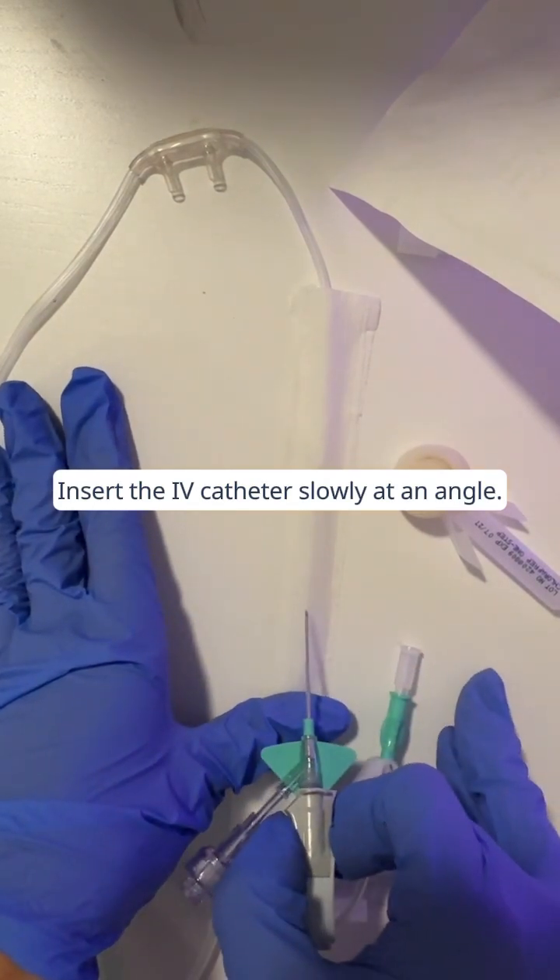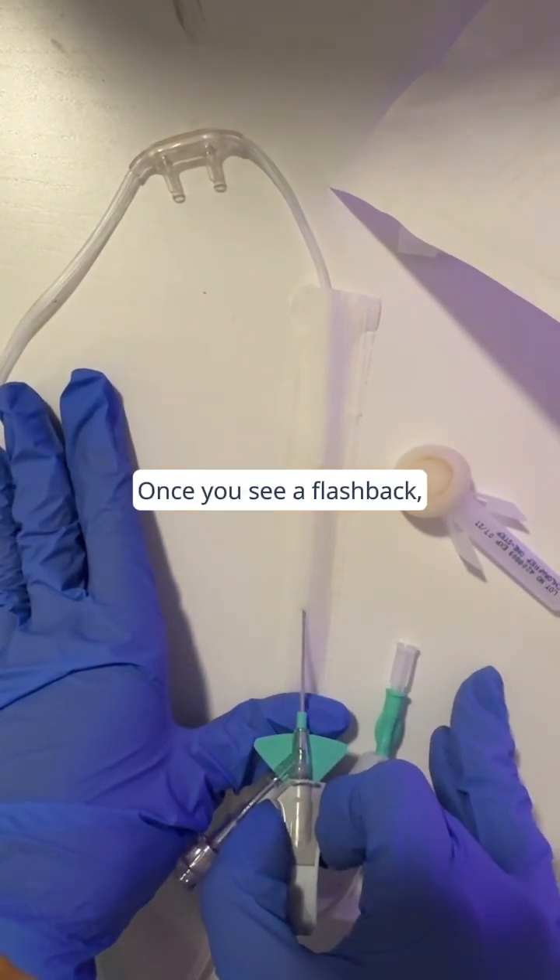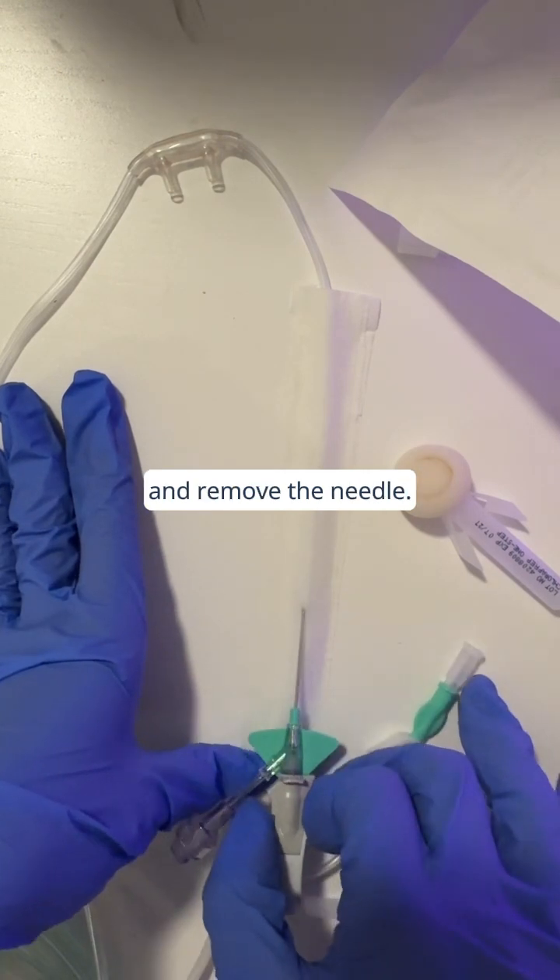Insert the IV catheter slowly at an angle. Once you see a flashback, lower the angle, advance the catheter slightly, and remove the needle.